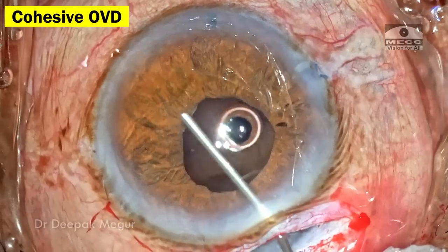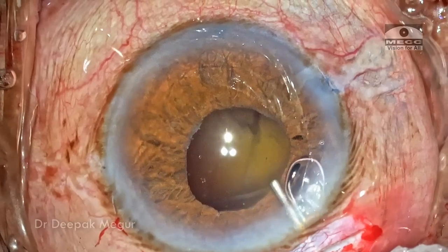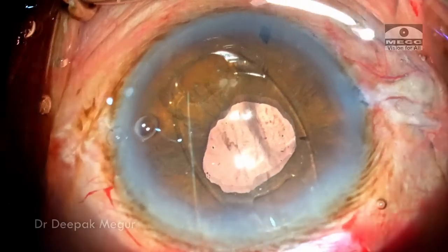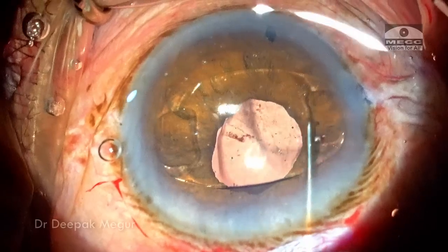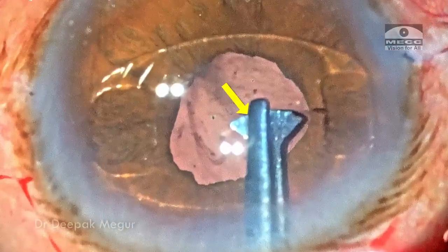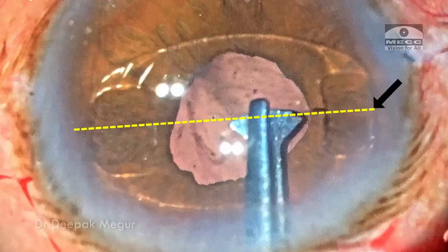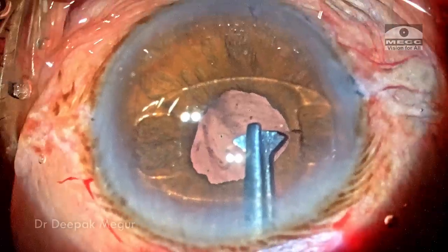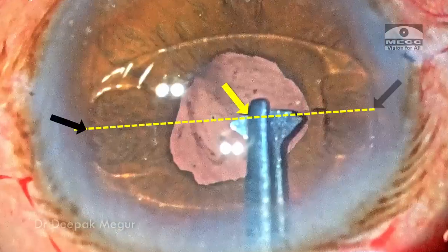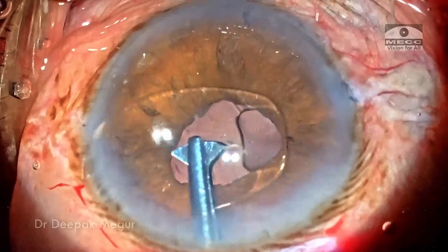I'm using cohesive OVD such as sodium hyaluronate to form the chamber before implanting the lens, which ensures the chamber is maintained slightly better. The iris claw lens is placed over the iris and then rotated to get the right orientation. I want to pause and show that the point at which I grip the lens with the iris claw lens forceps is exactly at the point where the actual claw or breach is in the haptic — this gives me indirect evidence of where to push the iris down for it to get enclaved. The moment the haptic goes under the iris we are blinded and don't know where the slit in the haptic is, so holding the forceps exactly at the line joining the slit in the haptic tells us the exact location of the slit under the iris.